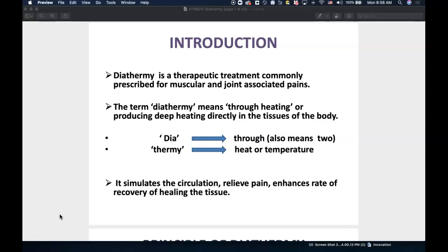I know it seems so weird because I've talked about diathermy a lot, particularly when I was lecturing on therapeutic ultrasound, and now we're finally here. I kind of saved this for the end of the course because it's a clinical tool that we definitely have to talk about, but certainly one that you won't engage with very often in the clinical setting. Yet still, you need to know it, number one, for your board of certification examination, and number two, if in fact you do encounter a diathermy machine in the clinical setting, that you would at least have an idea of what it is and physiologically what it does. So today we're going to focus on diathermy.